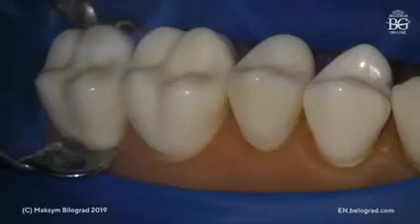Your dental technician will guide you regarding the thickness. He will say that in this case, for example, to change the A3 color of the patient's teeth to BL color, or to A1, let's say, or B1 color, the dental technician needs, for example, 0.5 millimeters of ceramic veneer to mask this color. Let's just pretend like this. These are not certain numbers, just an average that I imagine. In this case, you have to give your dental technician this space.